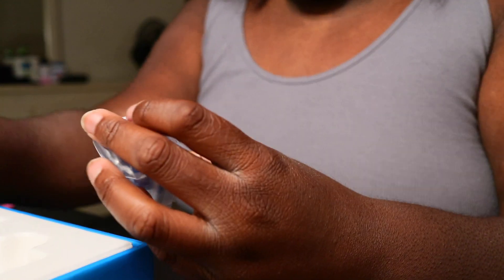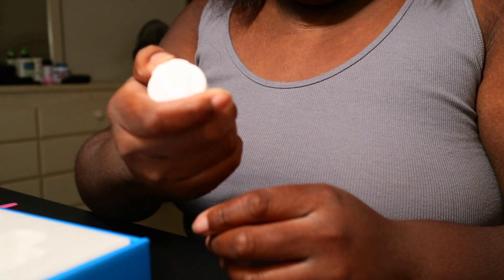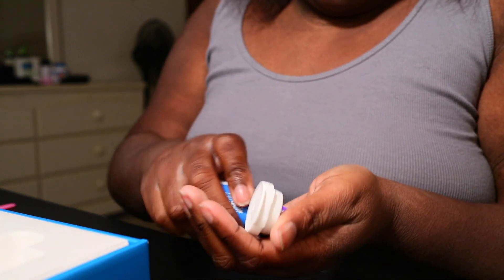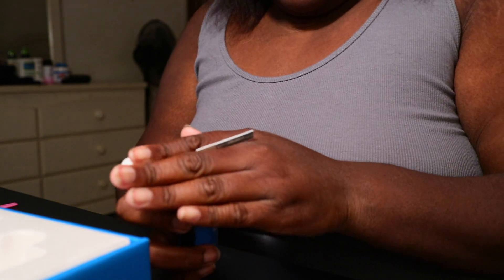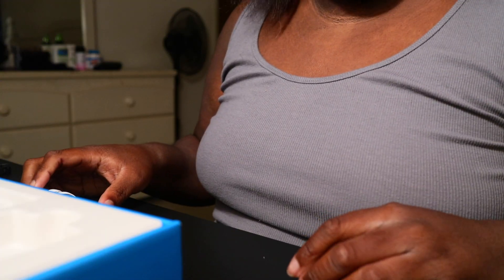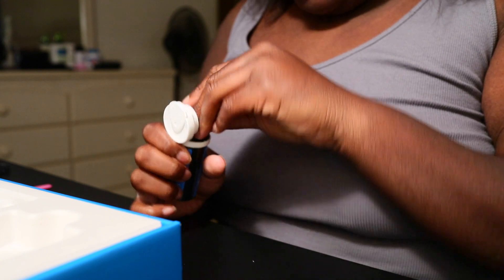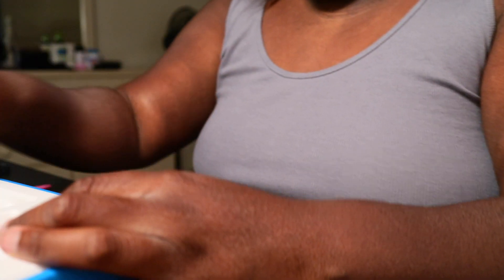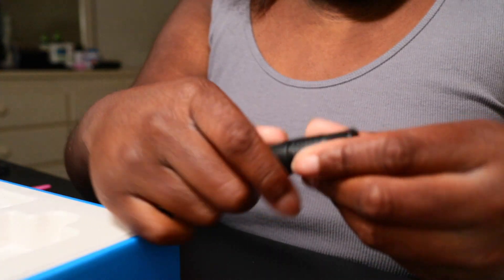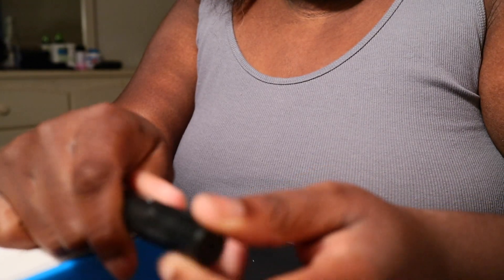And then these are your lancing devices — where it pricks your finger. And then you have your test strips, and they look like this. The tube is kind of hefty. Then next you have your lancing device — I guess you can twist it to control how far it needs to prick your finger.